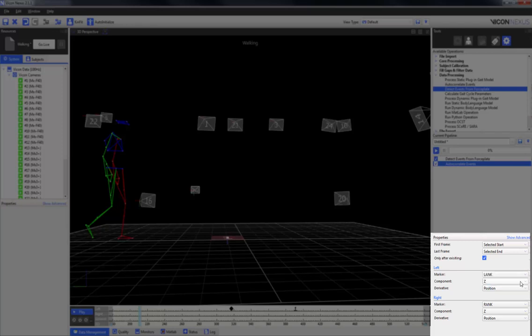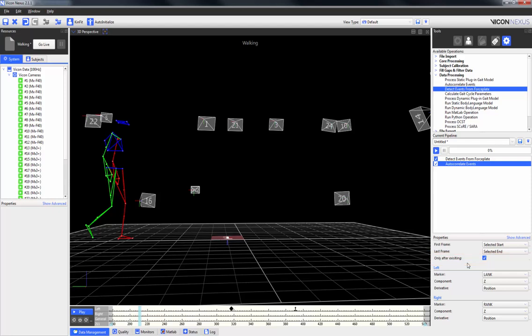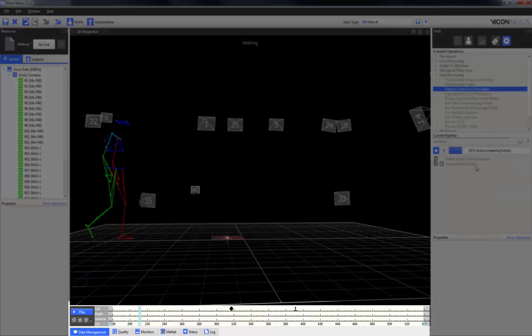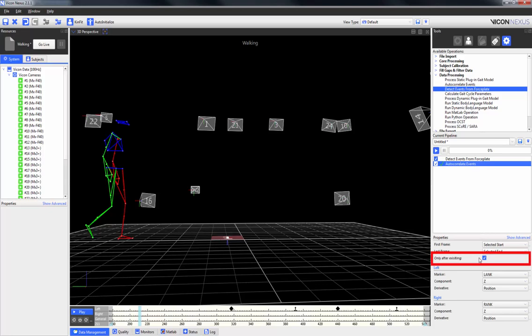You can also select whether the derivative is the position, the velocity, or the acceleration. Running this operation with the 'only after existing' box checked will result in events being placed after those that already exist. Unchecking the box and running the operation will result in event markers being placed before as well.